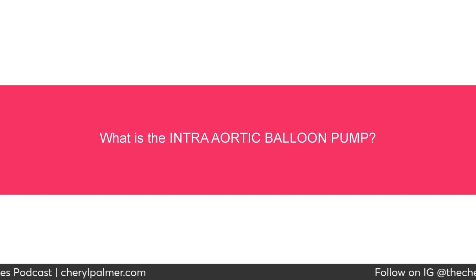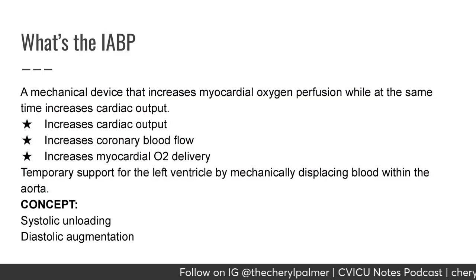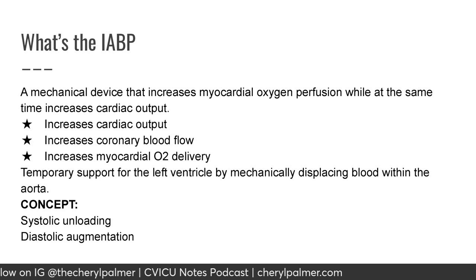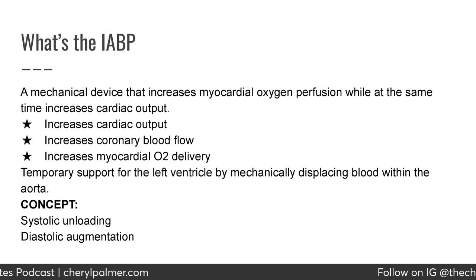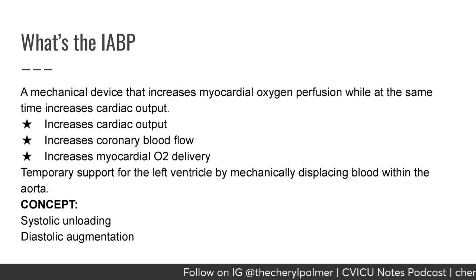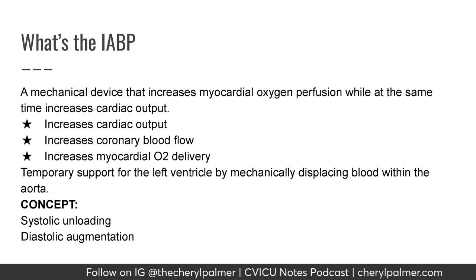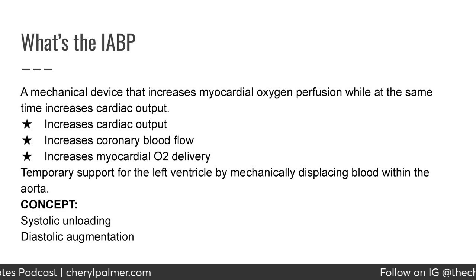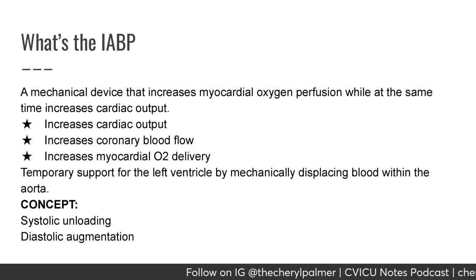What is the intra-aortic balloon pump? Well, the IABP is a mechanical device that increases myocardial oxygen perfusion while at the same time increasing cardiac output. It increases cardiac output, increases coronary blood flow, and increases myocardial O2 delivery. This is a temporary support for the left ventricle by mechanically displacing the blood within the aorta. The concept is systolic unloading and diastolic augmentation.